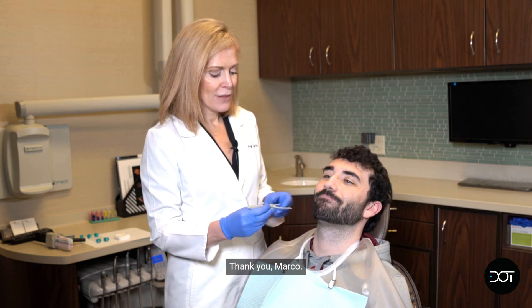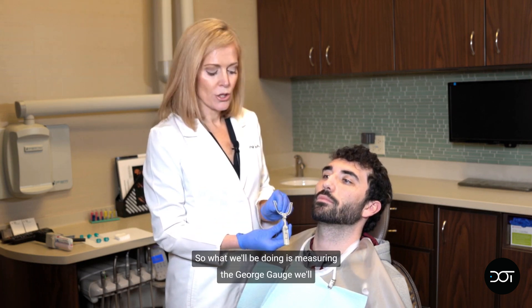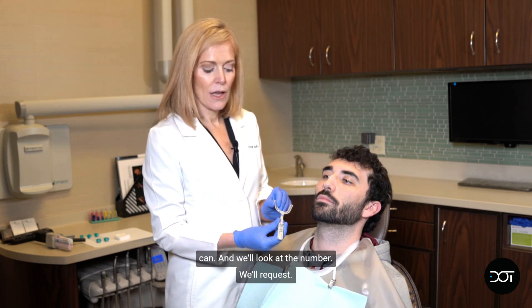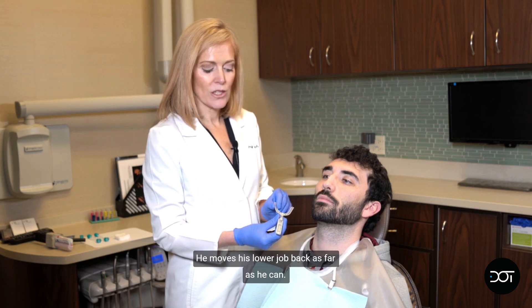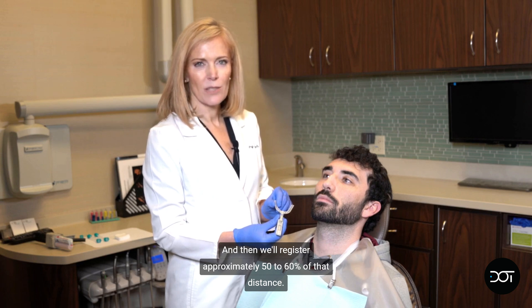Marco here is helping us out. What we'll be doing is measuring the George gauge. We'll request that Marco move his lower jaw forward as far as he can and look at the number. Then we'll request he moves his lower jaw back as far as he can and register approximately 50 to 60 percent of that distance.